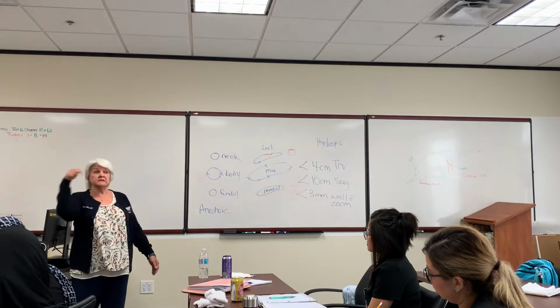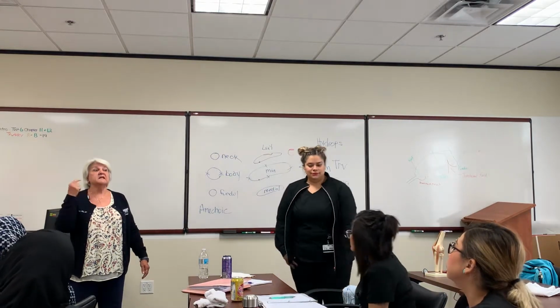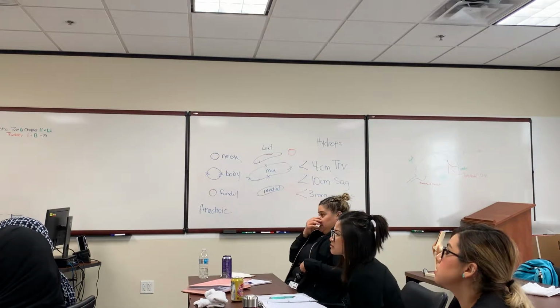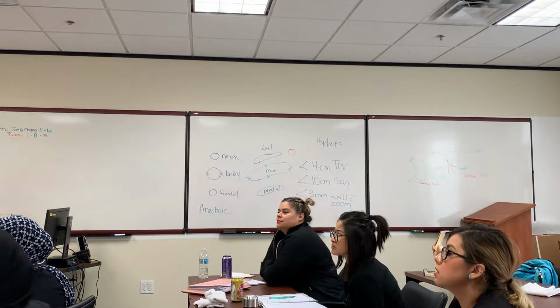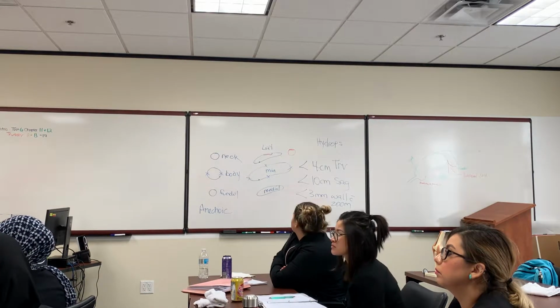I have them breathing so much that they don't talk to me. Okay? Taking a deep, and this is how I do it. Taking a deep breath, hold it, hold it, hold it, let your breath out. And when you can, go ahead and take in a deep breath. Take that deep breath in a little bit bigger. Yes, that's just right. Just go ahead and take in a deep breath. Hold it, hold it, hold it. Now let your breath slowly out.